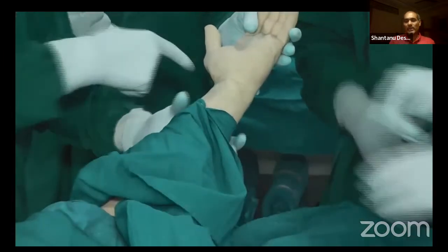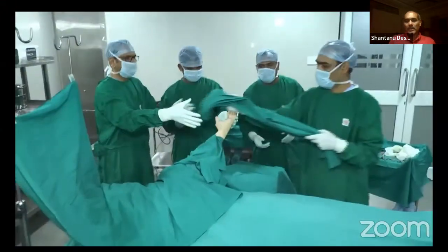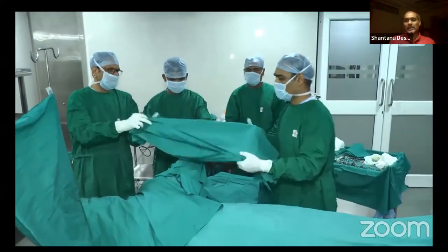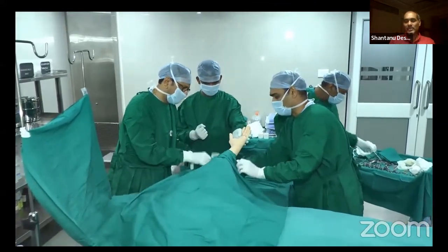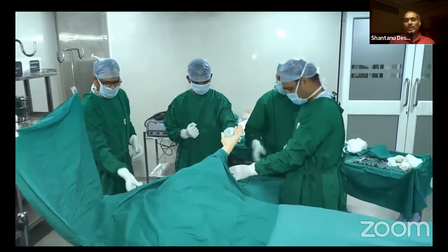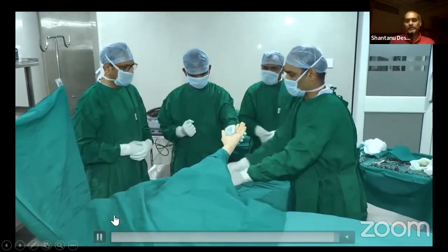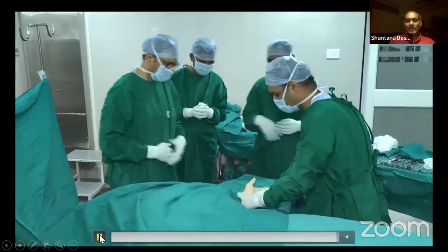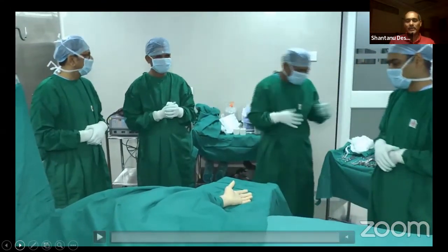So that is something to remember, that our surgical plan and incision is going to dictate which area or extra drapes you are going to use, but make sure you use it as a double drape. Then the hand portion can be rested onto the trolley.